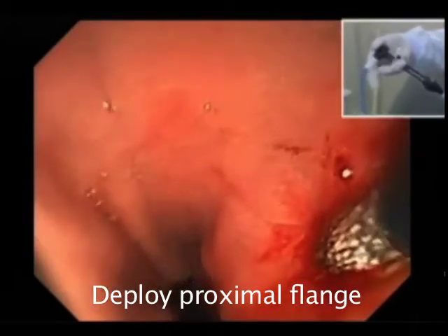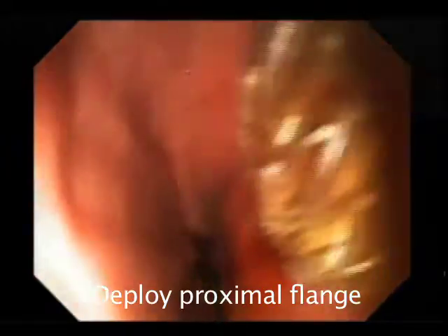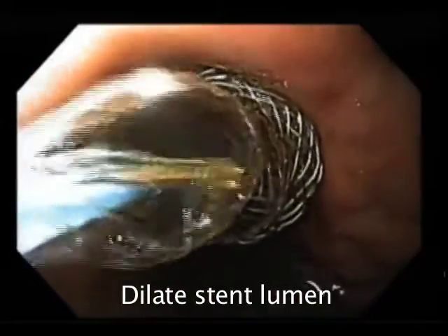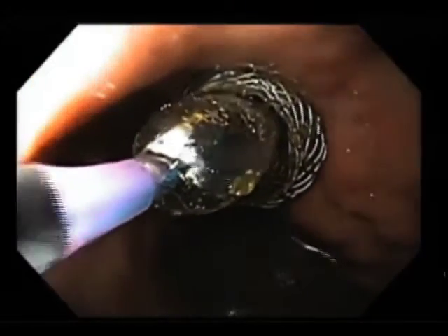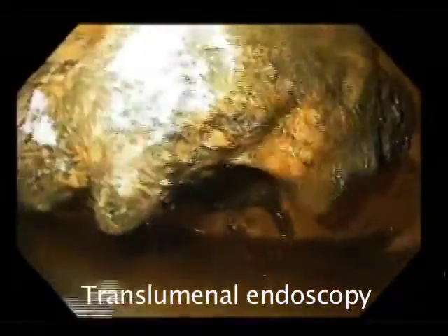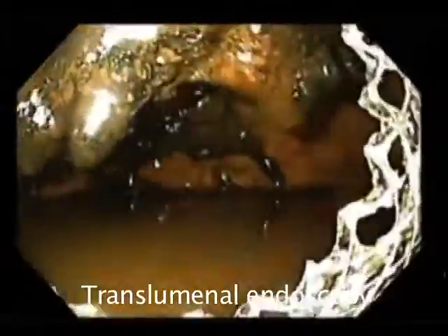Under endoscopic guidance, we deploy the proximal flange of the stent. The stent lumen is then dilated with a CRE balloon to enable passage of a standard endoscope across the stent into the target lumen, in this case, a pancreatic fluid collection filled with necrosis.